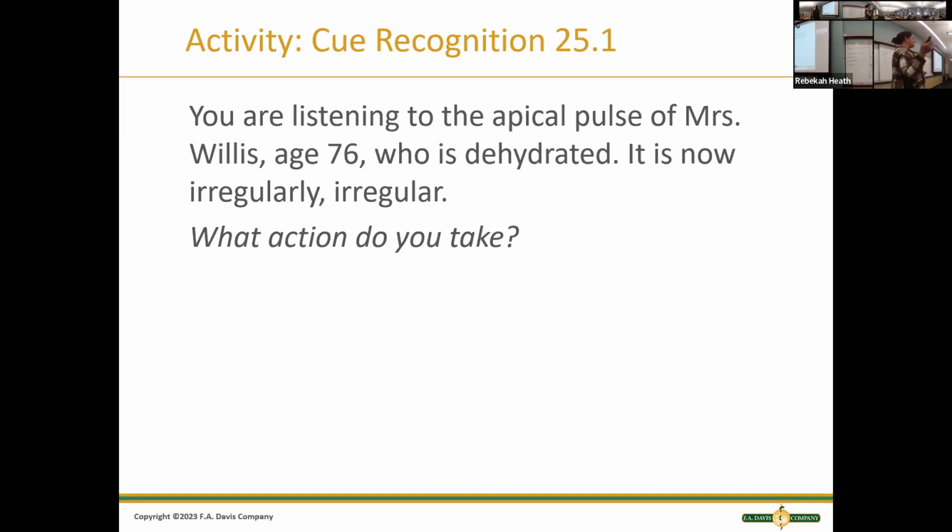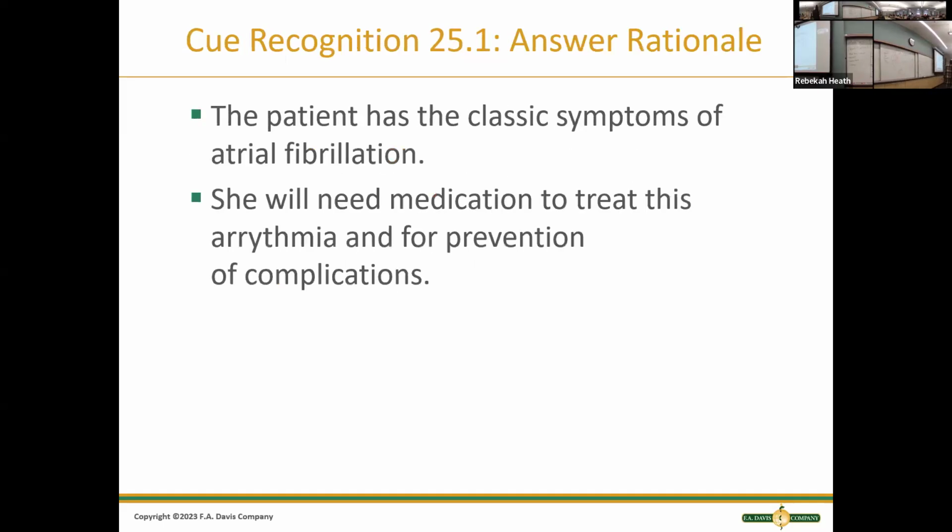Yeah, check the patient, do vital signs. Do we have an EKG? Notify the provider. Yeah, absolutely. These are classic symptoms of atrial fibrillation.